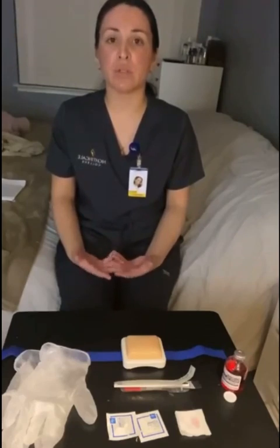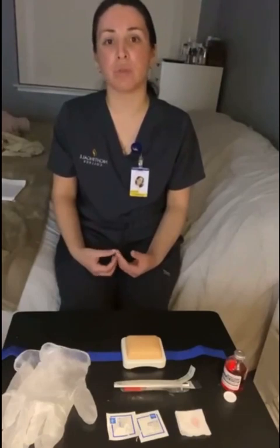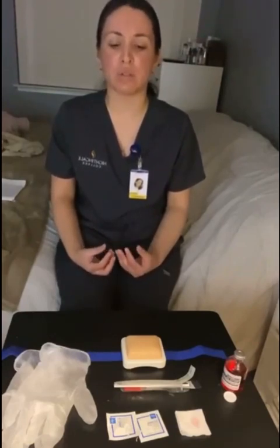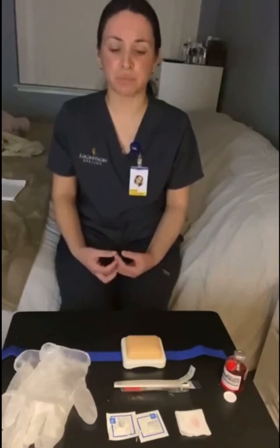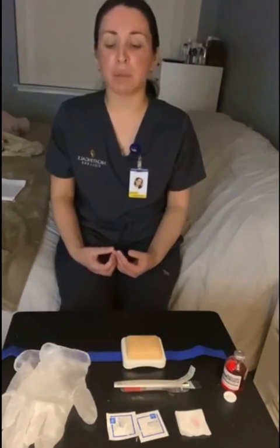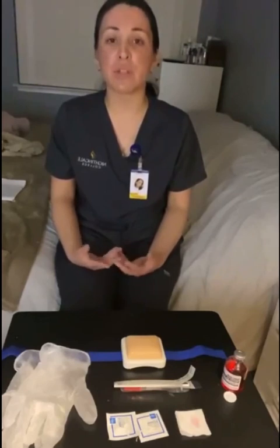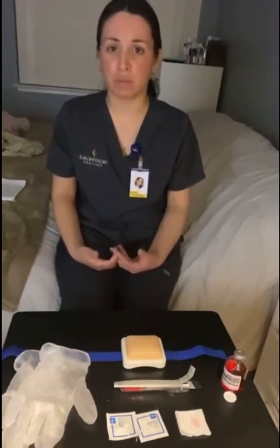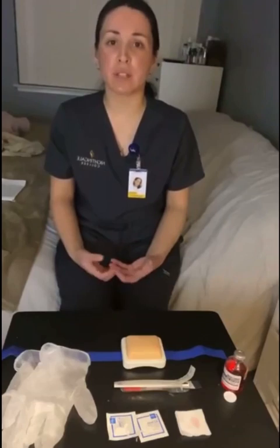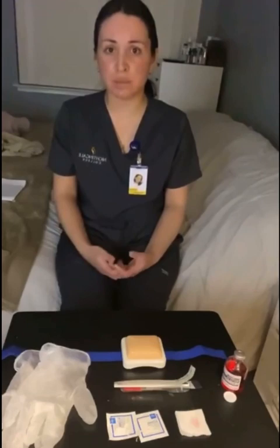It's 5 tuberculin units per 0.1 milliliters of the medication. Its purpose is to aid in the detection of tuberculosis infection. Some common side effects include itching and redness at the site. You might feel some stinging and burning sensation as I inject the medication. Induration at the site is expected if you have a positive reading. Some adverse effects include bleeding and rash at the site of injection within 12 hours of administration. If you experience any of these adverse effects, please report them to me immediately. Do you have any questions?